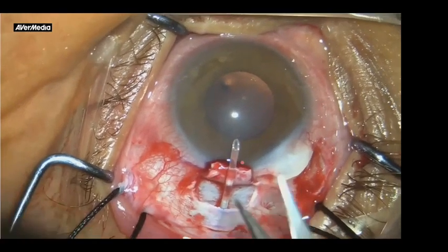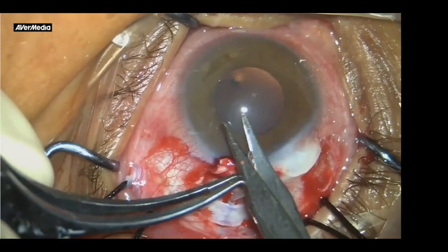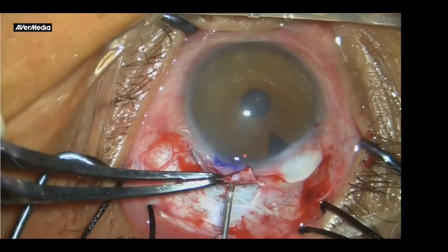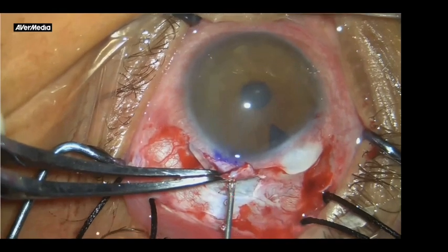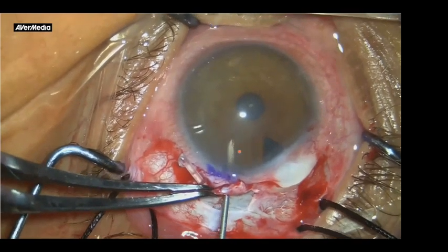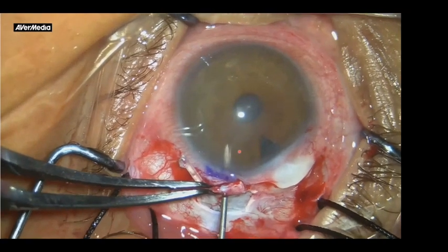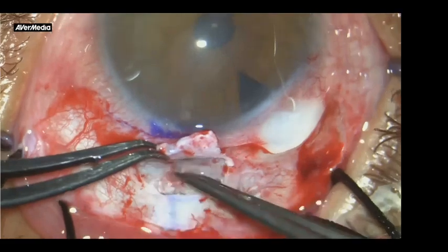Again, the remaining part of the tube is relatively small. You make it beveled, and beveling is towards the cornea. If it is toward the iris, it can occlude it. Again, this is the moment of piercing the anterior chamber. The needle will go parallel to the iris or even slightly towards the iris, but not towards the cornea. And it is the direction of the needle that will control the orientation of the tube inside the anterior chamber.